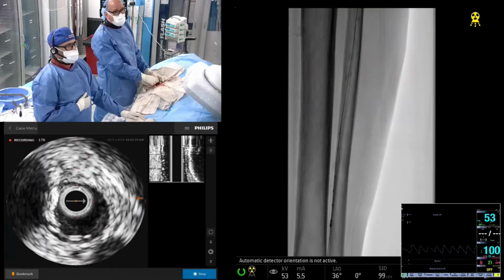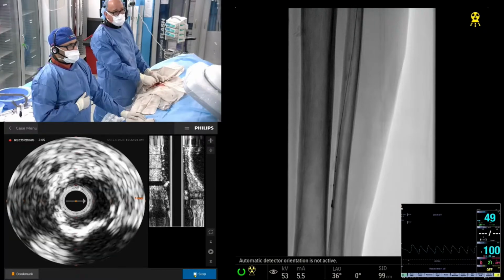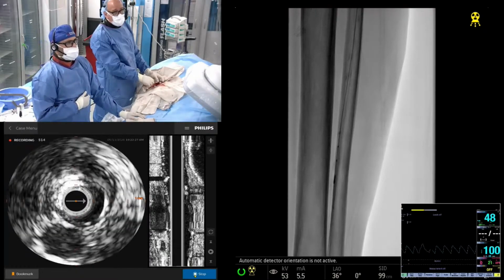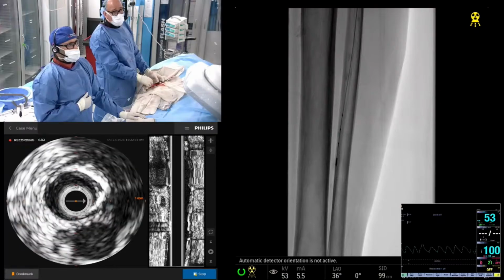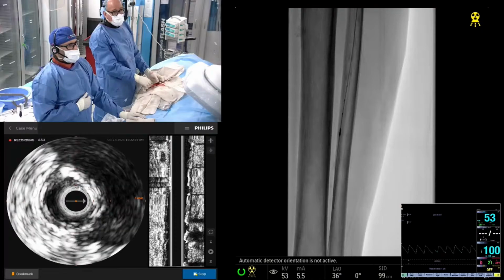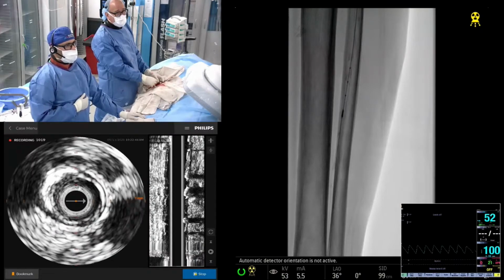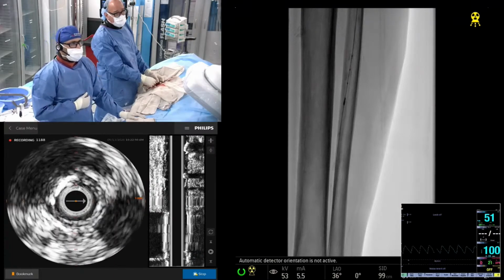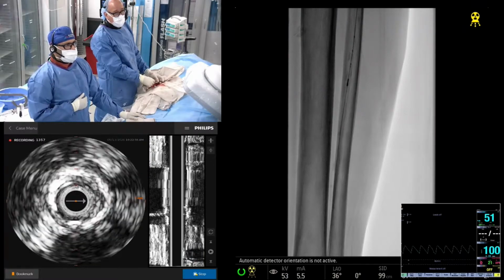And I'm just pulling back. And you see a mild stenosis there, maybe, some severe calcification there. Again, a lot of calcium here, a lot of calcium. Here's some plaque. And you can see the diameter of the anterior tibial is changing dramatically, right? And just as an example there, that looks to me like it's closer to 3. The lumen is far less than that. This is a very tight stenosis there. You see no lumen at all. Right?